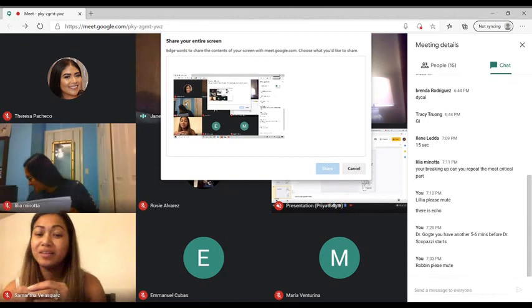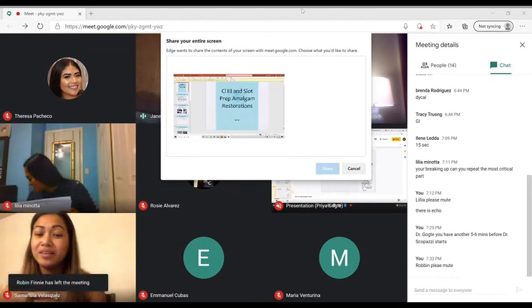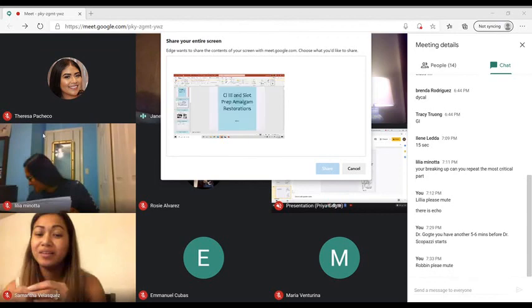The difference from a composite to an amalgam is that when you pack an amalgam, you cannot use the clear matrix system that you use for a composite, because you need to burnish and pack against that matrix system. You will need a wedge, and you will need a Tofflemire and the matrix band around it.